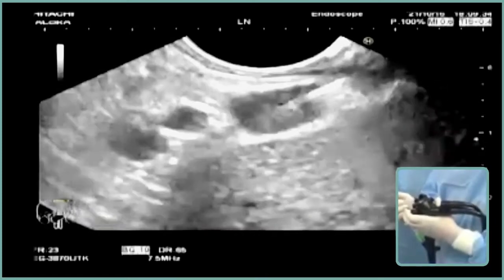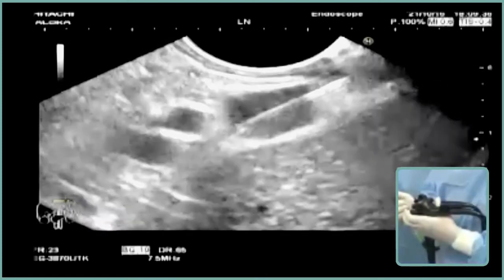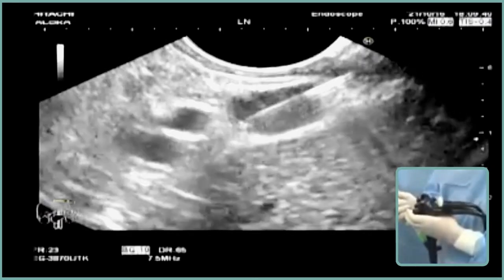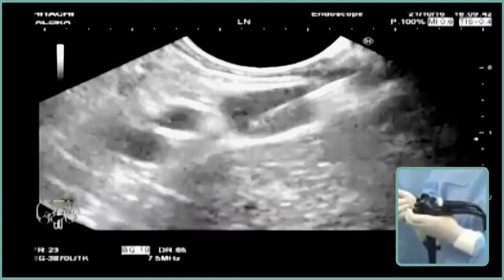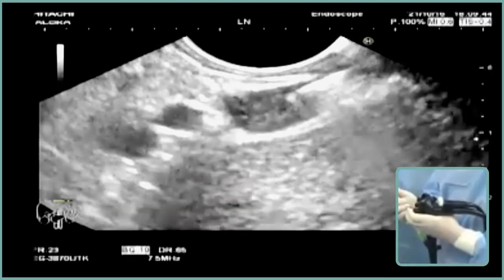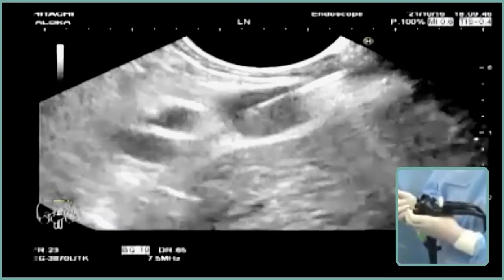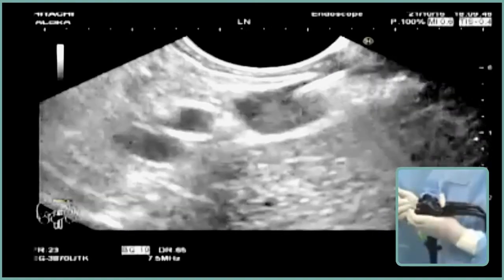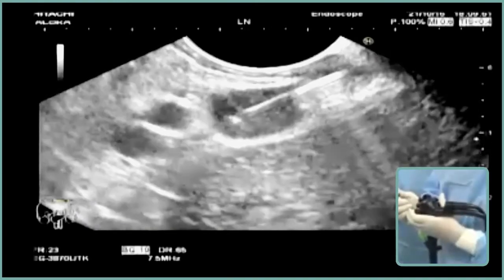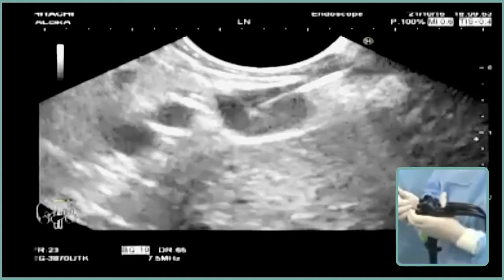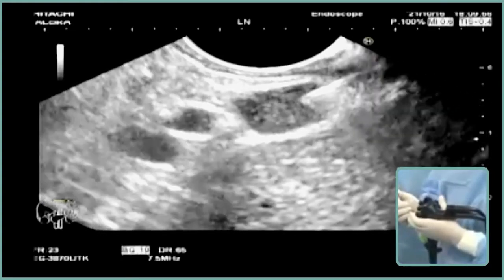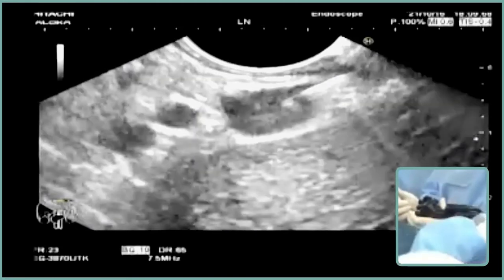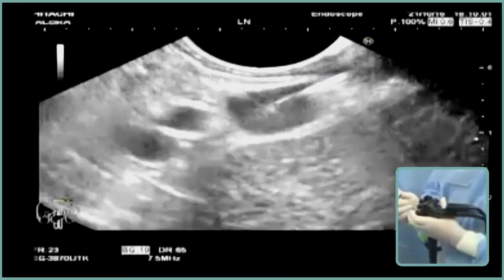This is the fanning technique. So we used all our weapons: we did FNB instead of FNA; we did two passes from two lymph nodes, not only one pass; we did the fanning technique; and we used both low pressure and high pressure suction in the same lymph node.